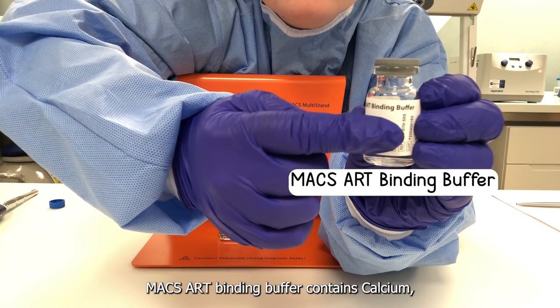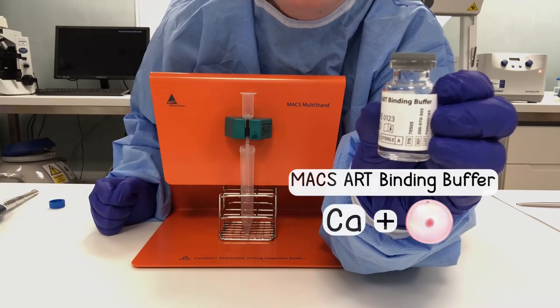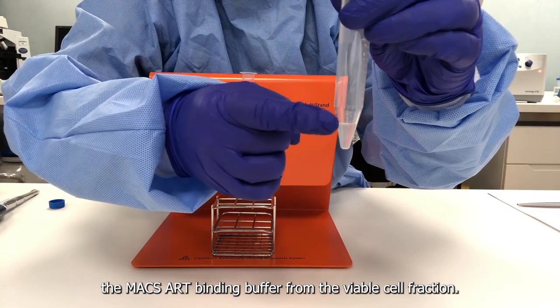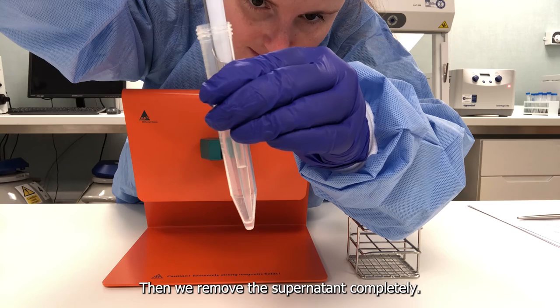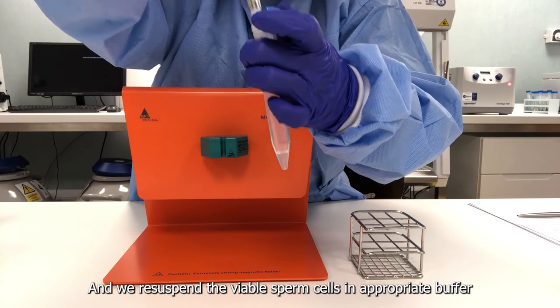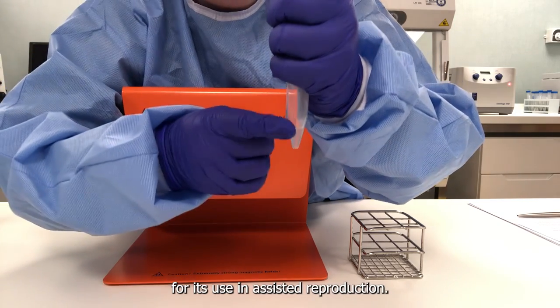MACS-ART binding buffer contains calcium, which is known to activate the oocyte. Therefore, it is important to remove the MACS-ART binding buffer from the viable cell fraction. So we centrifuge the cell suspension, then we remove the supernatant completely, and we resuspend the viable sperm cells in appropriate buffer for use in assisted reproduction.